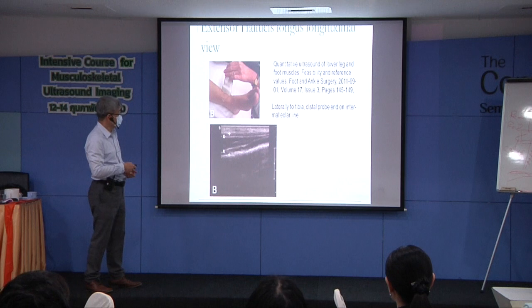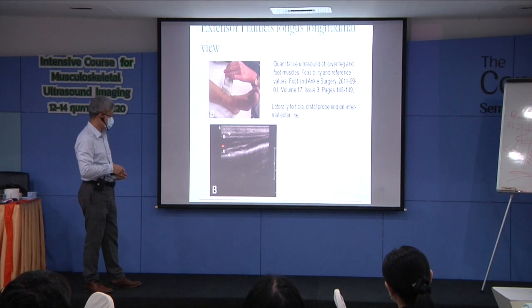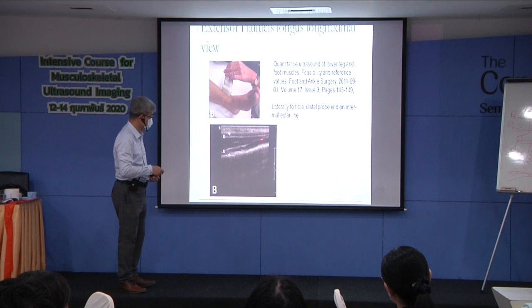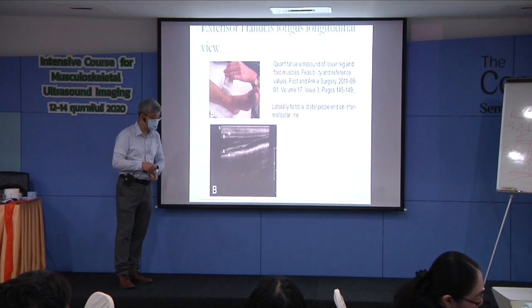So you look at the tendons and you notice there are some muscle fibers underneath. Good. That's the extensor hallucis longus. Typical pictures of extensor hallucis longus.